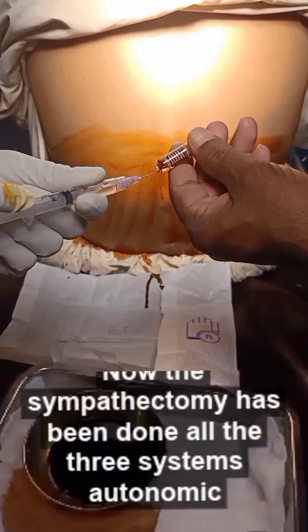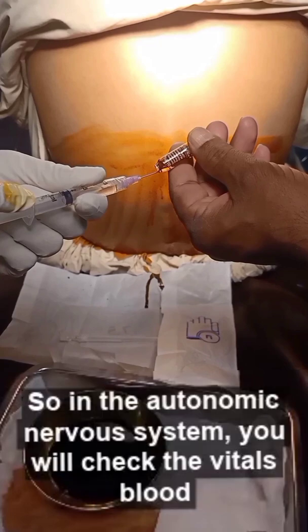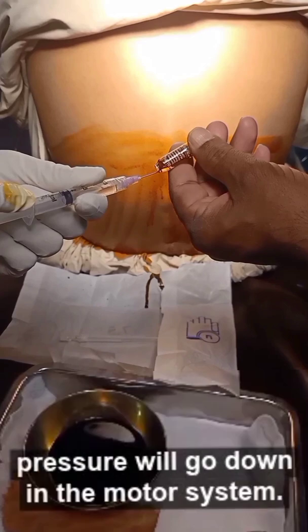Now the sympathectomy has been done. All three systems — autonomic, motor, and sensory — have been blocked. In the autonomic nervous system, you will check the vitals; blood pressure will go down.